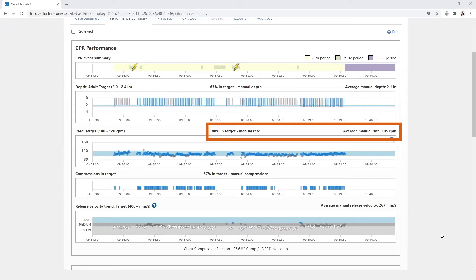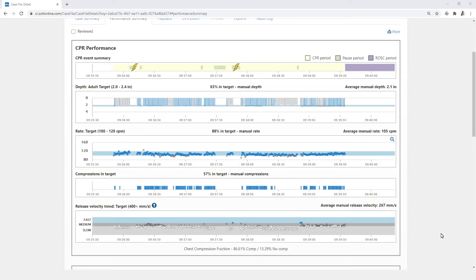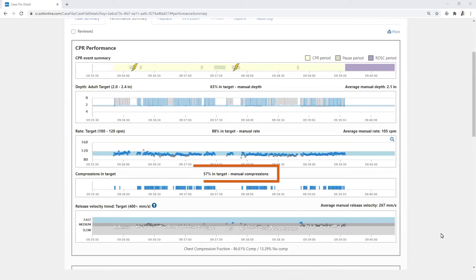Compressions in target represent those compressions that are within the target range for both rate and depth. Those compressions are displayed in blue in the graph and as a percentage in target.